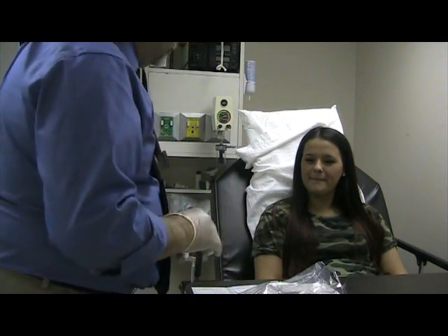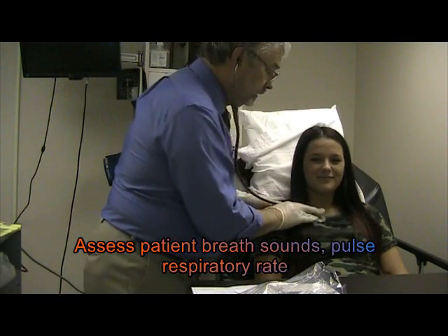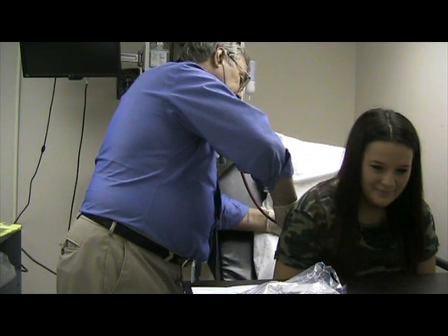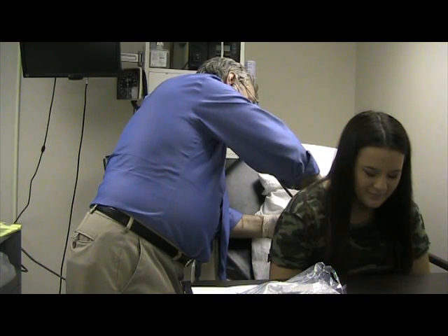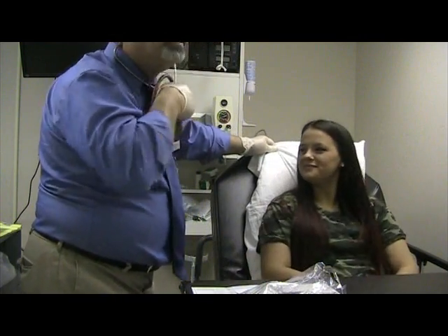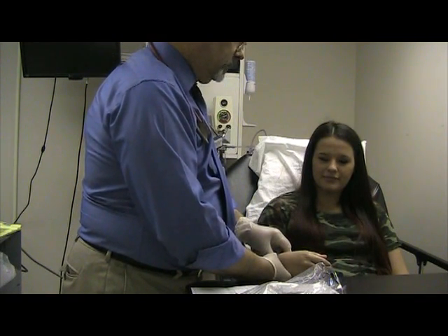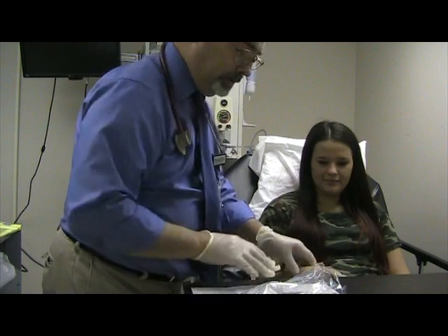The first thing I need to do is listen to your breath sounds. Just going to listen. Could you lean forward? Lean back. And I need to take your pulse. Nice strong pulse. You're breathing very nice.